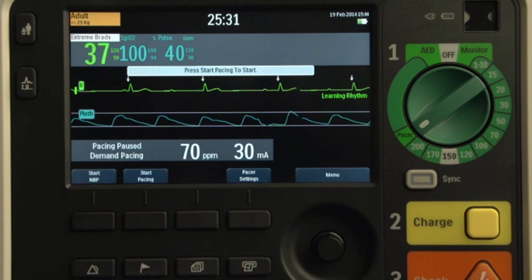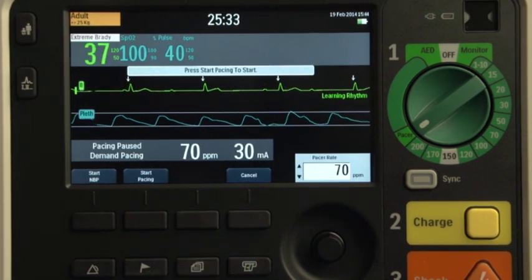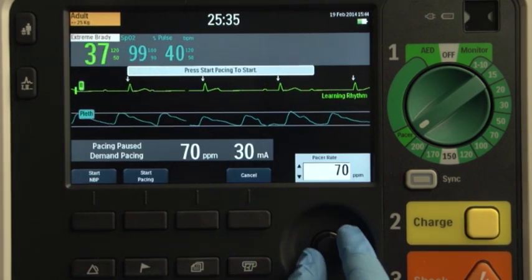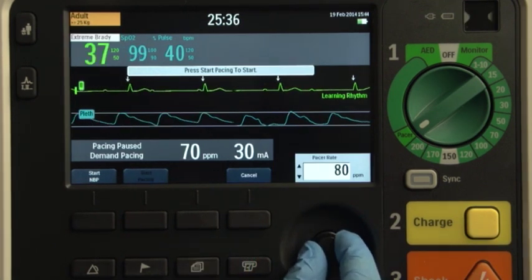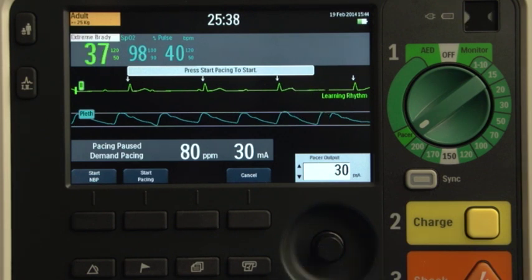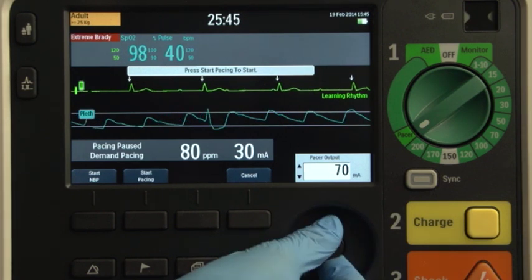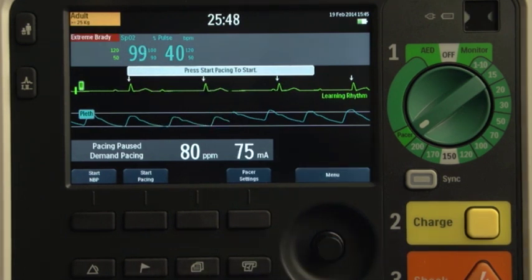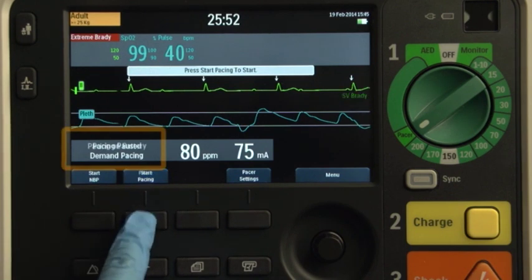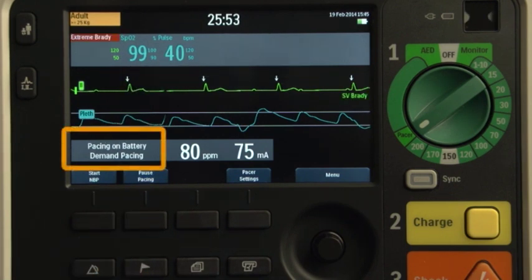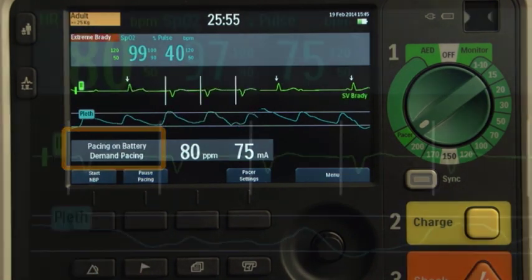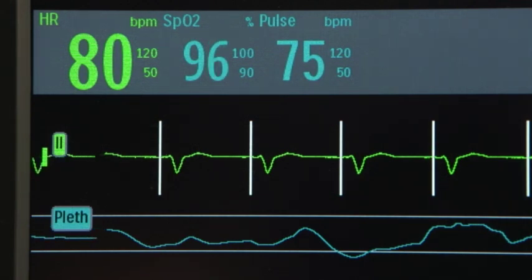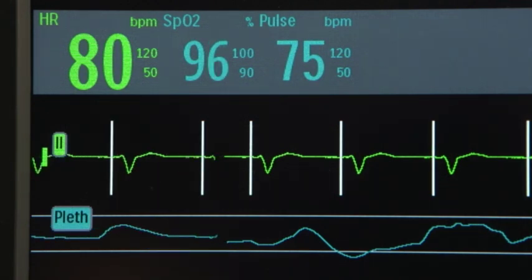Press the pacer setting soft key to bring up the pacer rate window. Use the smart select knob to adjust the rate and then press the knob to select the rate. Repeat these steps to adjust the pacer output if needed. Press the start pacing soft key and the message pacing appears. Confirm that the white pacing markers appear on the ECG waveform.